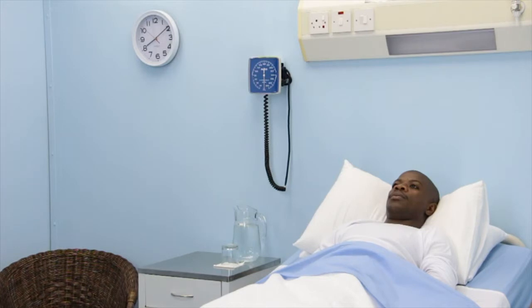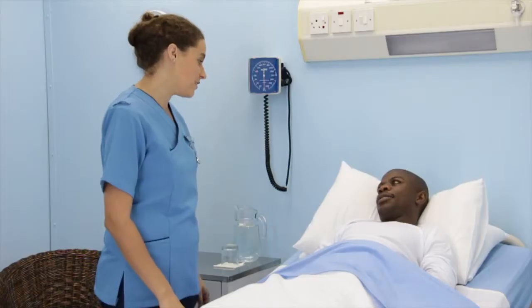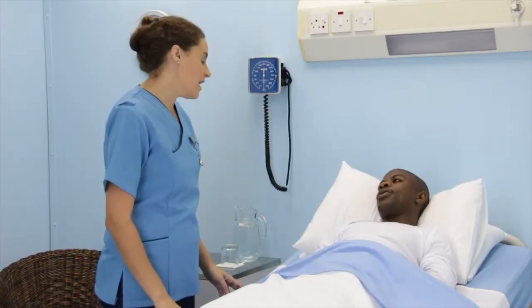Procedure. The procedure will be performed according to the nursing process. Assessment. Identify the patient. Greet the patient and introduce yourself. Ask the patient to state his or her name.